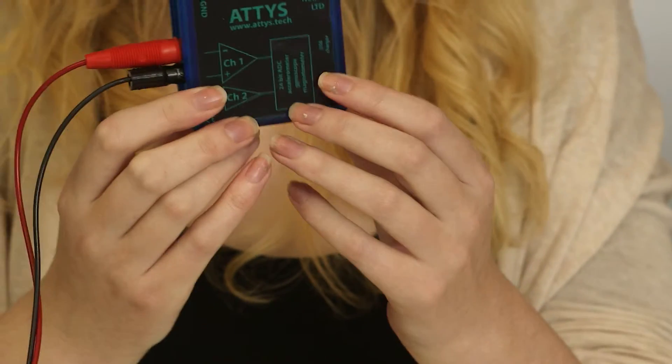Hello. How would you measure temperature, pressure, or even my heart activity and feed it directly into this tablet or phone? In order to do this with one single device, we have created the Attys. Let me show you how it works.